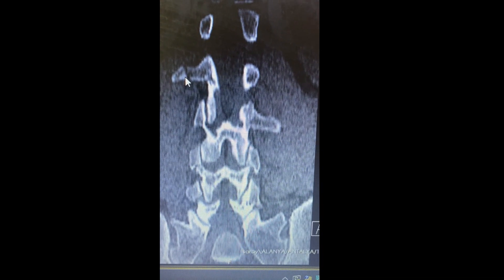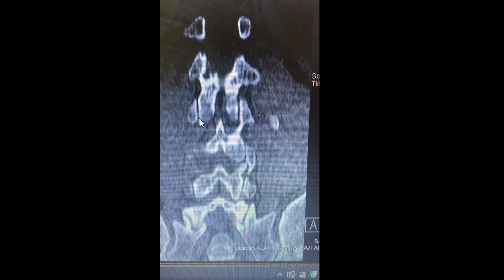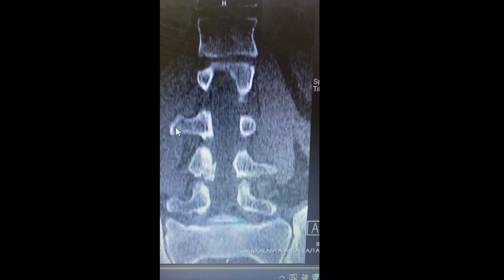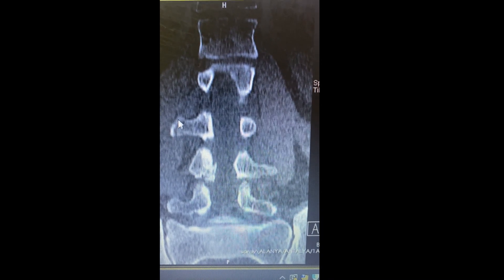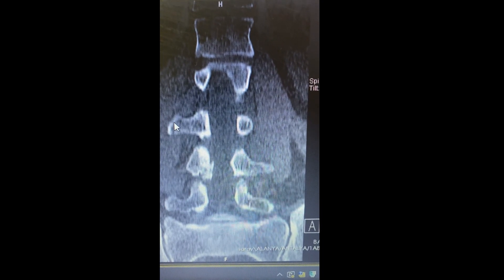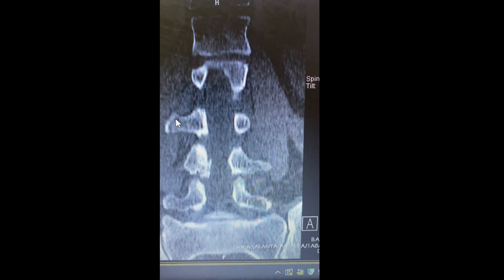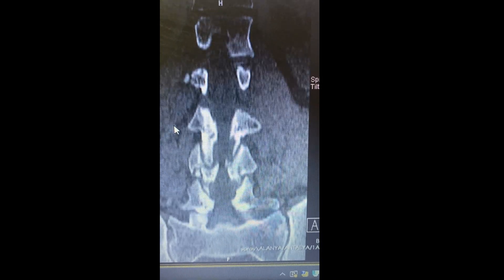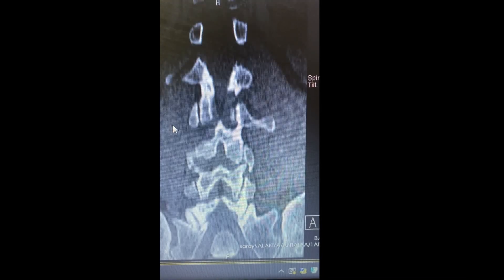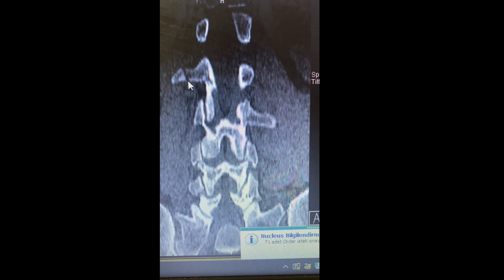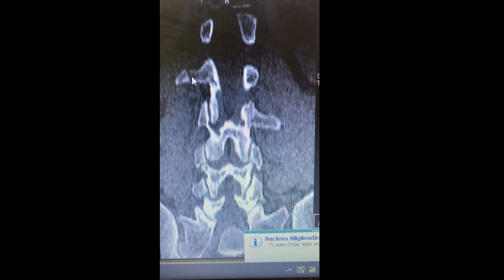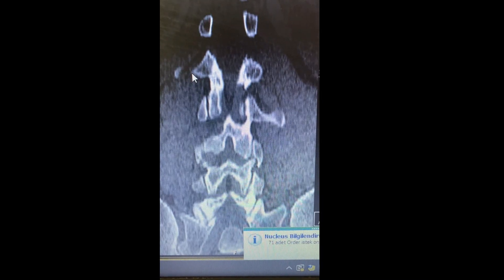As you see with the cursor, I'm showing the transverse process fracture now. Interpreting the lumbar CT, there is also a small fissure in another vertebra's transverse process. I'll confirm that a second time — I'd like to show you that there is a transverse process fracture.